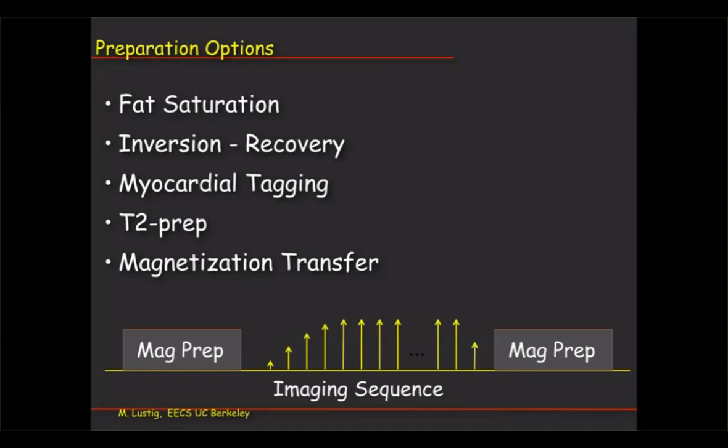except that you also have field inhomogeneity. And so that could be a problem, because let's say you have a linear variation in the field and you try to separate, like excite fat, and you excite at 460 hertz, let's say, away at 3T, but you might then saturate water, which is off resonance at some other places, right? So there's always trade-offs there.